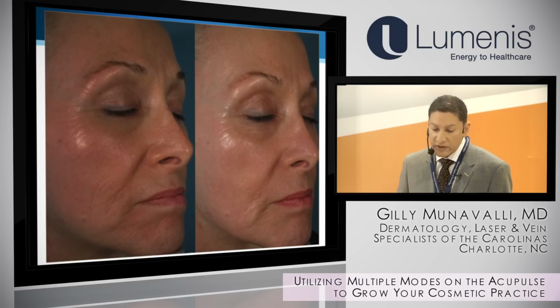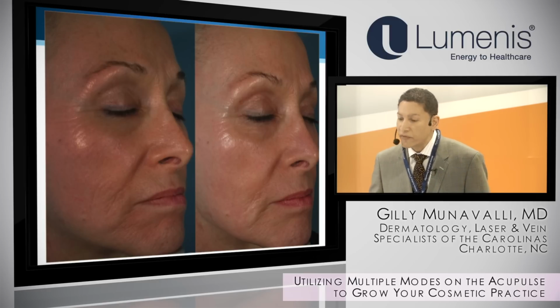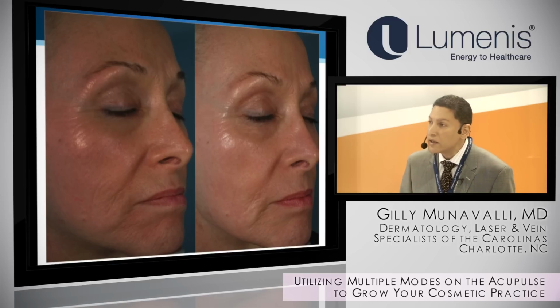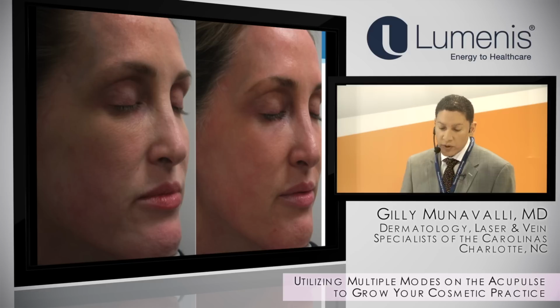Small spot sizes. So this is the type of patient you might say, well, you could treat with the fractional laser. But actually, after one feather touch treatment, you can see how much the fine lines have improved, especially around the eyes, and they've gotten more contraction. I find that I get much more contraction with the feather touch mode. So this was one patient.